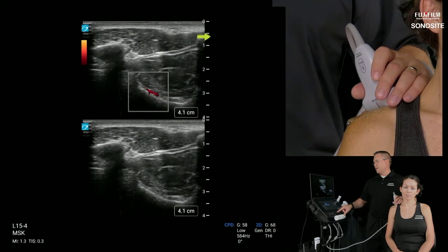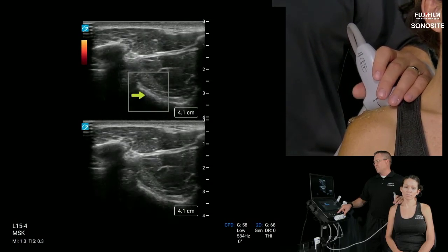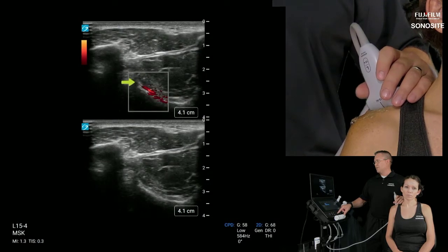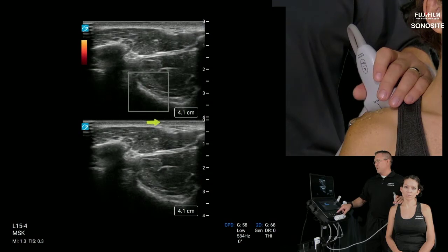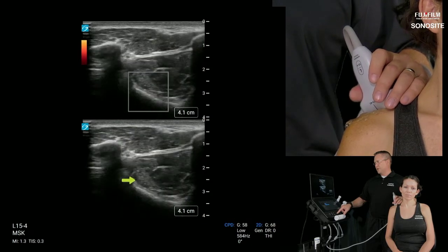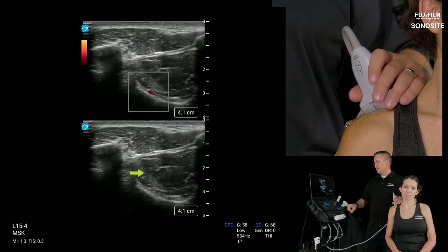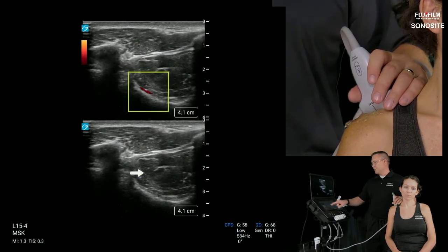The angle we were taking earlier is leaning the transducer from the spine of the scapula anteriorly into the wall of the supraspinatus fossa, right as that suprascapular notch forms right here. So we were taking a very hard oblique angle there, and it's kind of nice to see this top bottom where the artery is not in my way. If I were doing a procedure, I would know what to miss and also get a good clear shot of the needle. I'm going to turn off the color compare so we get a full screen.